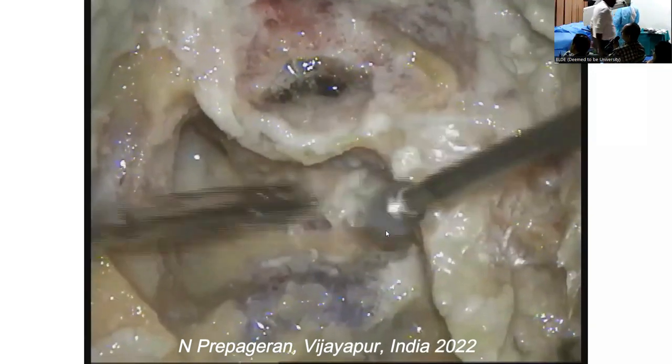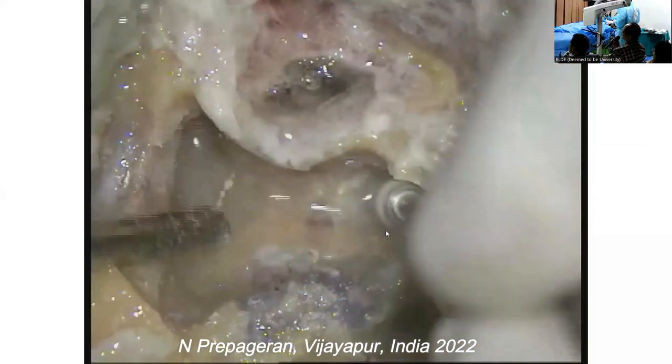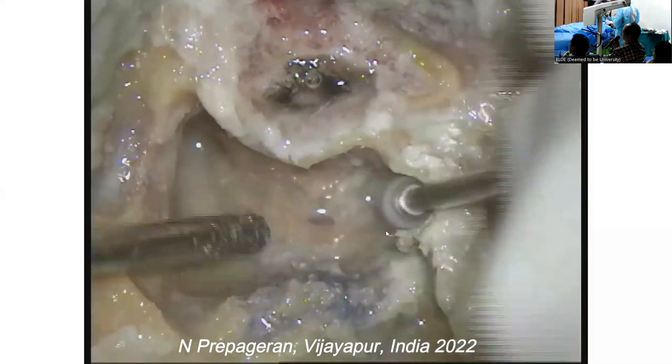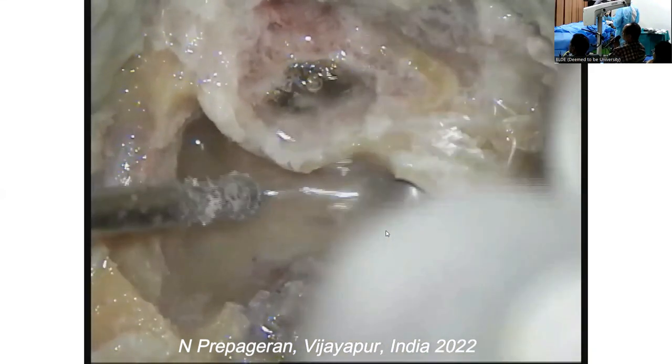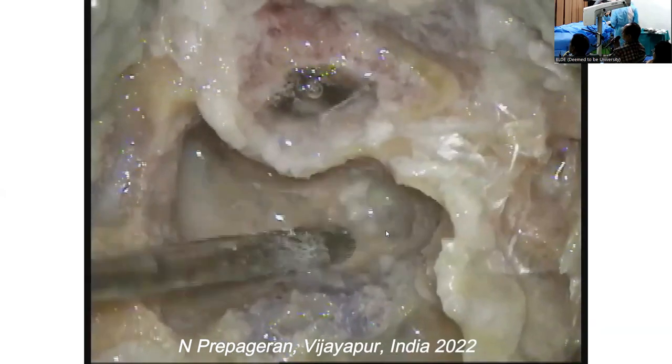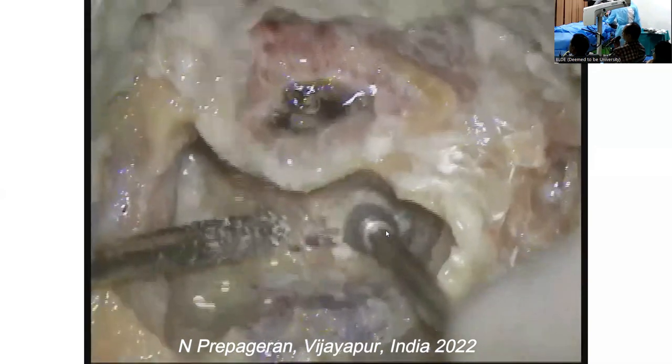So now let's follow the jugular bulb. You open the mastoid. The problem with a small cutting burr is you tend to plunge. Yeah. Okay. Now, can you see the jugular bulb coming to view?